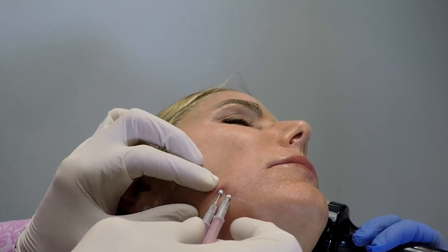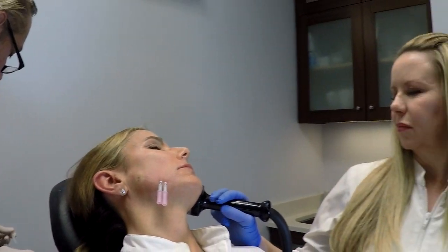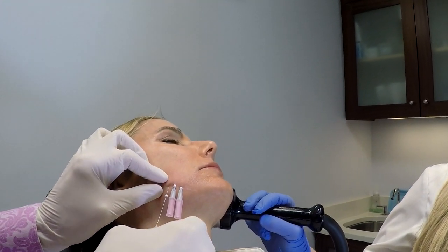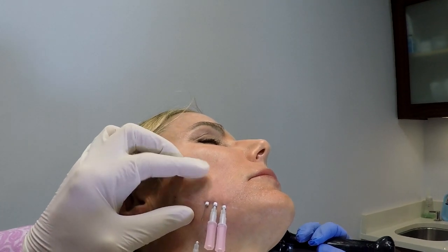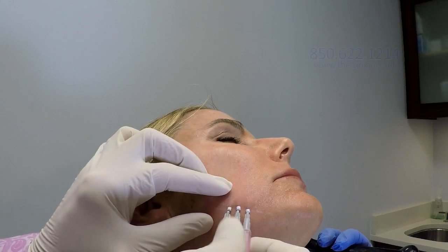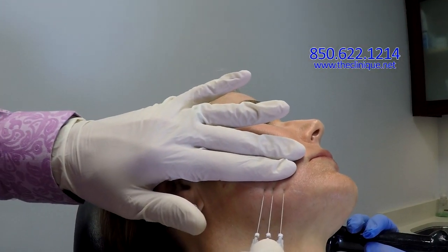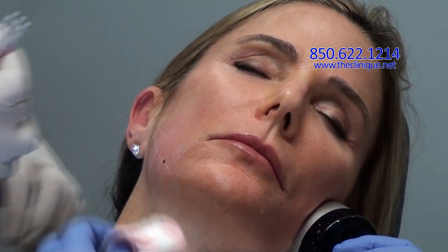And what this does is it produces a collagen reaction. And this is typically what you do. You kind of put in so you know where you've been. You put them in together, and then you just remove them. And you see there's minimal bleeding associated with that.